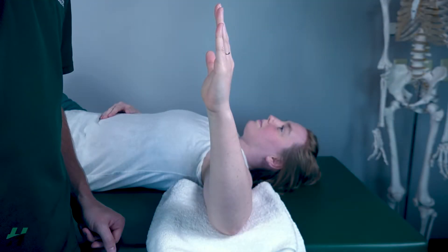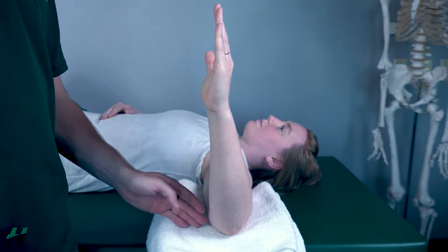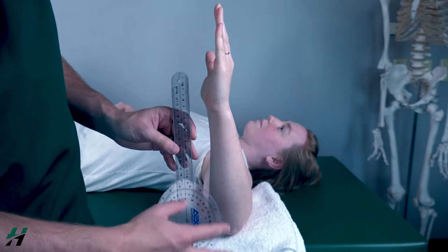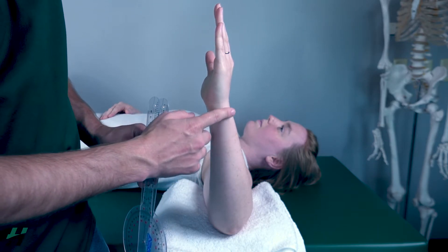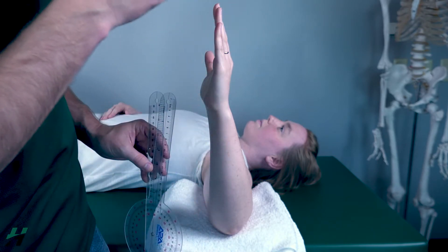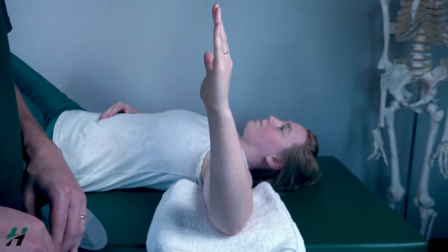Measuring shoulder internal rotation, the patient will be in a supine position with the shoulder and elbow at 90 degrees. Just like external rotation, we're going to line the axis of the goniometer with the olecranon, the movement arm following the styloid process of the ulna, and the stationary arm perpendicular with the ceiling. Rachel, if you could perform internal rotation for me.